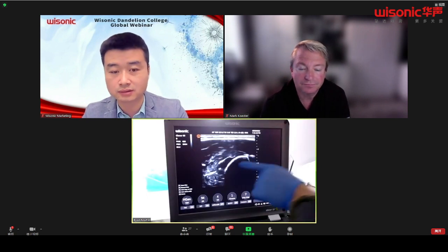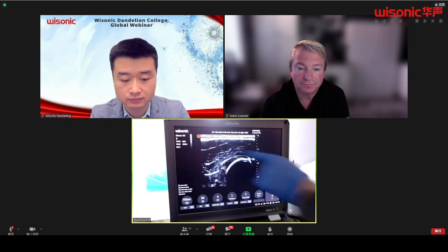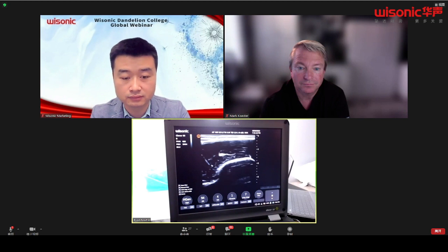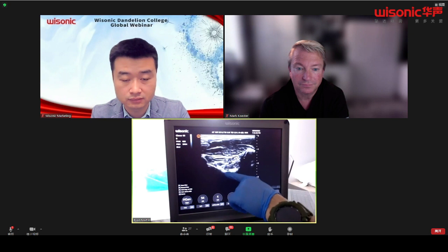So we have the humeral shaft right here. We have the tricep right on top. We're going to follow that down until we see that little divot. There's that recess right in there, that humeral recess, right? And that's the one that will get filled with effusion right in there. Now that's going to disappear. So this is going to kind of disappear.